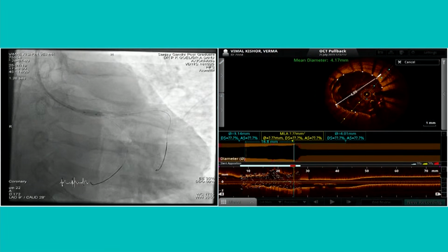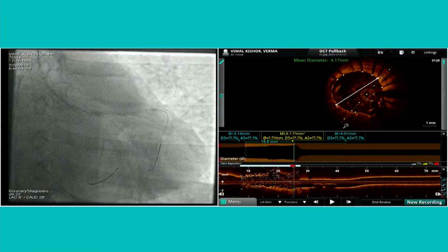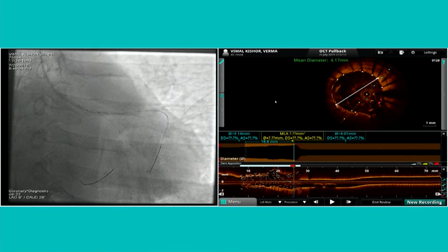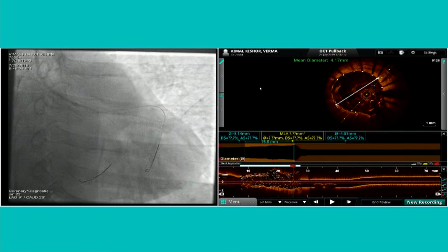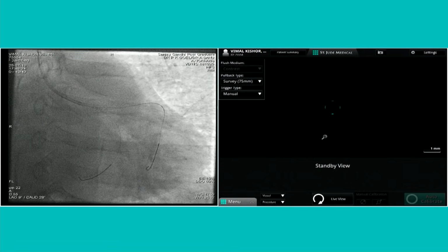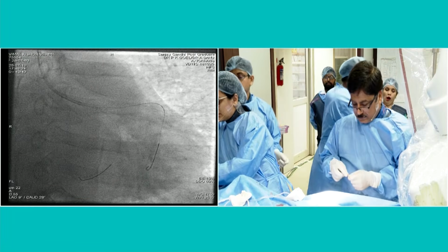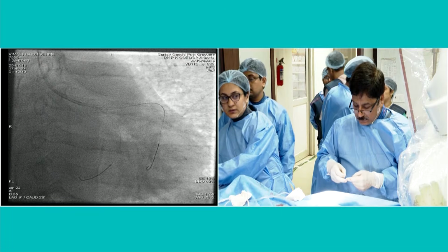I have only a general comment. I have to say this is actually the beauty of doing imaging for the left main, because if you look at the angio, you will never anticipate that that stent is not very well apposed. You will say it's finished, so it's done. Nevertheless, if you look very carefully with IVUS or OCT imaging, you see these kinds of things, and we all know how important apposition is for stent failure at follow-up. So particularly for the left main, I would say we need to use more imaging overall.